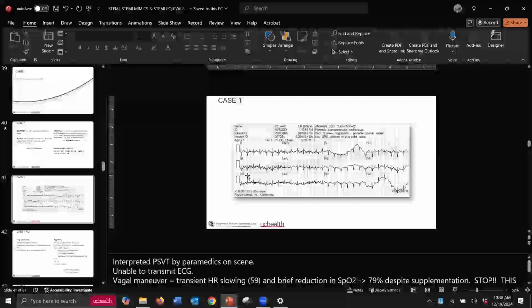I'm sure some of the audience was spot on in getting oxygenation improved, right? If you put her on oxygen and she gets up to 88%, but her heart rate decreases by 10%, is that the problem? Shake your head this way. Yeah, we just haven't appreciated enough oxygen, right? That's where I would be cautious to rate control this. Hell, maybe this is AFib with RVR.